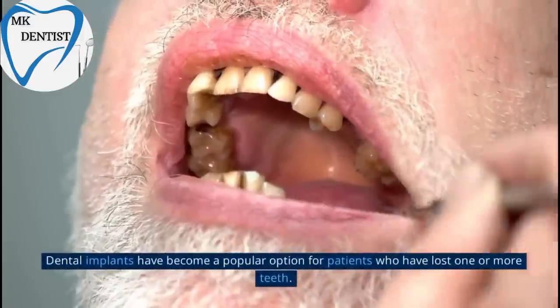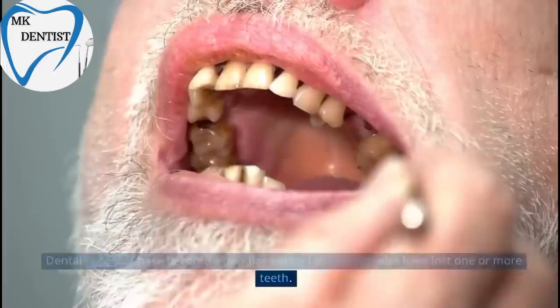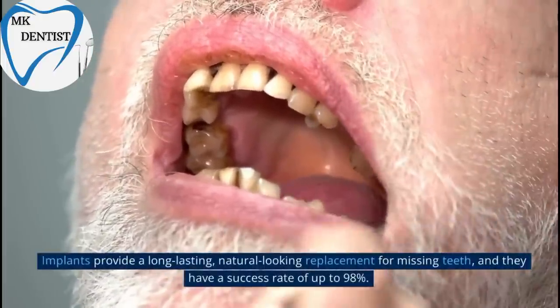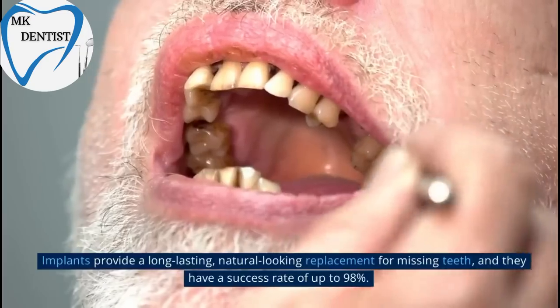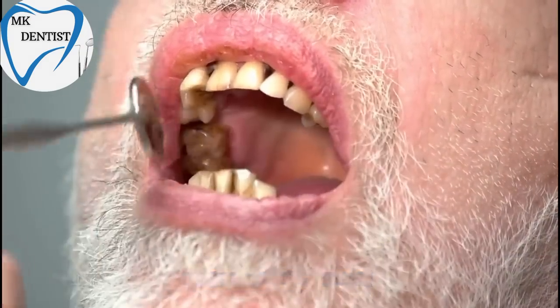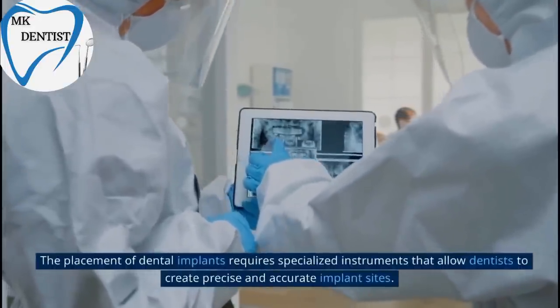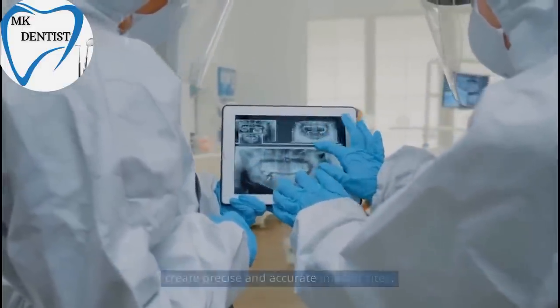Dental implants have become a popular option for patients who have lost one or more teeth. Implants provide a long-lasting, natural-looking replacement for missing teeth, and they have a success rate of up to 98%. The placement of dental implants requires specialized instruments that allow dentists to create precise and accurate implant sites.